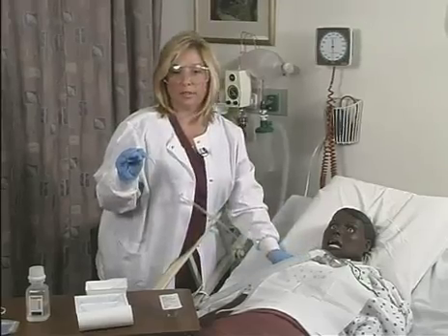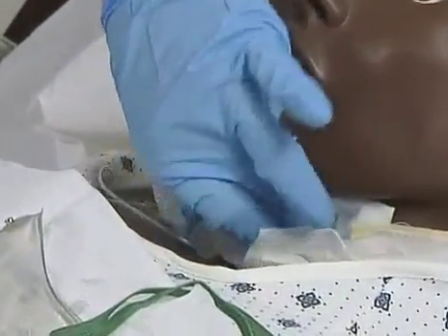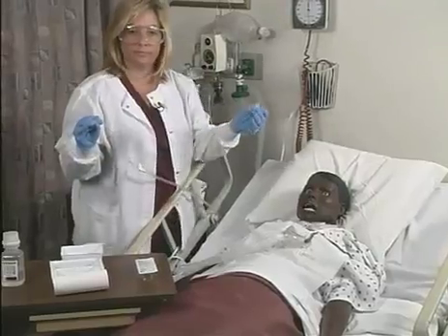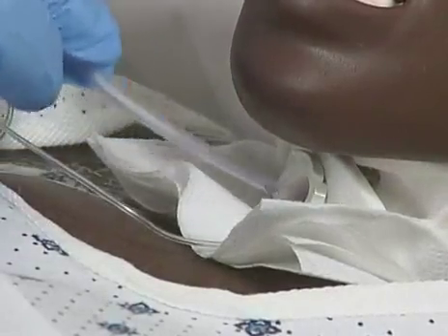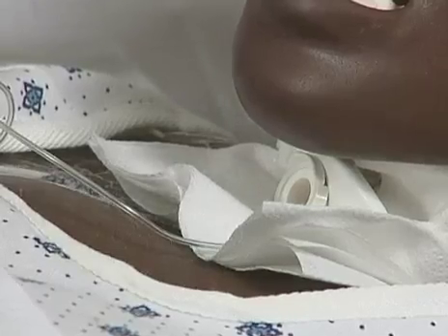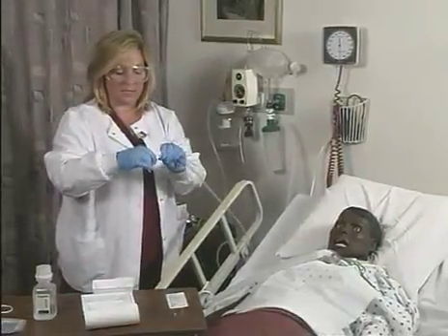Let her rest for a moment. Now I'm going to remove the inner cannula. Mrs. Jones, I'm going to remove the inner cannula, and this might make you cough. I remove the inner cannula and dispose of it. If I see any remaining secretions near the trach, I can go ahead and suction those secretions that I visualize. I'm going to return the tracheostomy mask and continue to oxygenate Mrs. Jones as I dispose of my suction catheter.